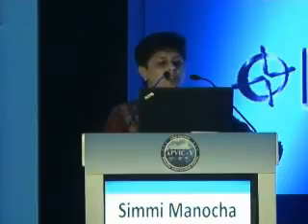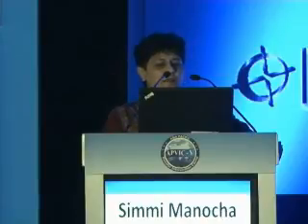It is important to start deep to not miss findings in the far field. Once the area of interest has been identified, you can adjust it. Once the far field has been surveyed, the depth can be decreased in order to focus on the area of importance. If the depth is decreased, then superficial structures will be magnified, which will improve the resolution.